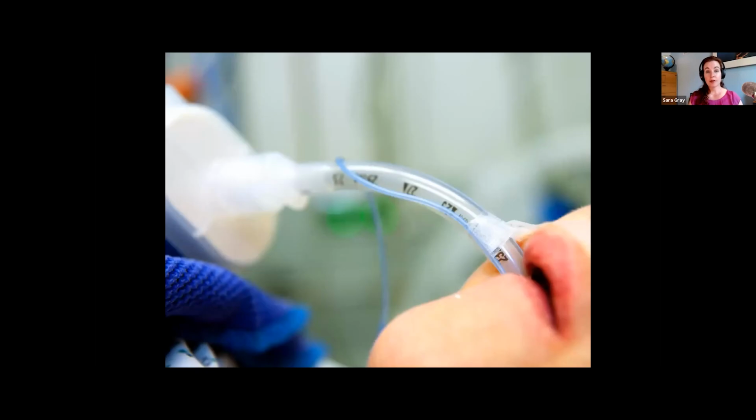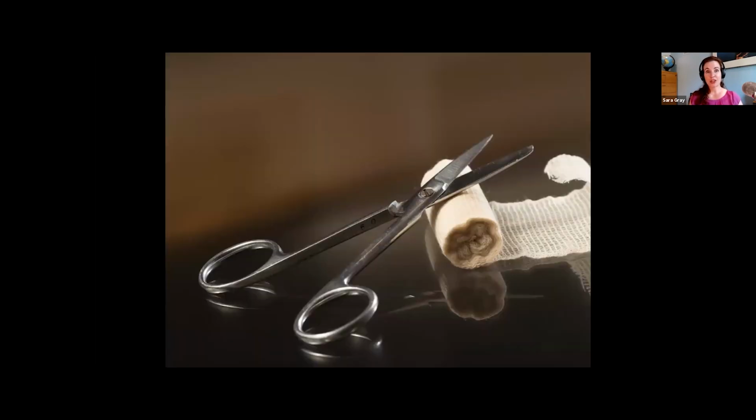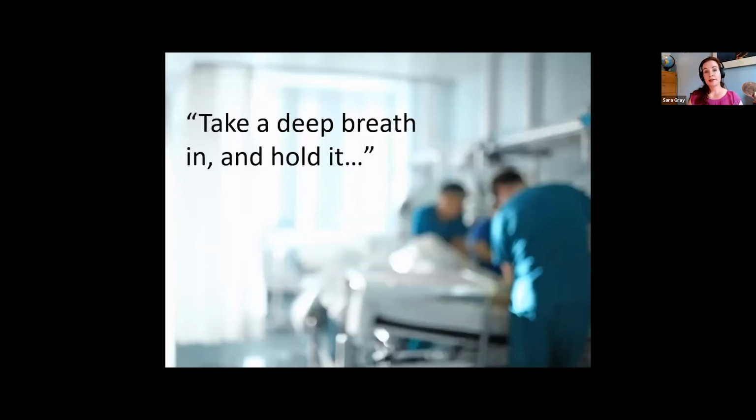The next step is grab tight to their endotracheal tube, because you're going to hold it and control this process, and you're going to use scissors or whatever you need to cut through the ties or the tapes or remove the anchor fast or whatever is securing their tube. You're now going to release it, so you're just holding the tube in their mouth. And at this stage, you need to do a little bit of coaching with your patient. Ideally, they're sitting up, and you just say to them, hey, take a deep breath in and hold it, because you're going to pull the tube out at the end of inspiration.